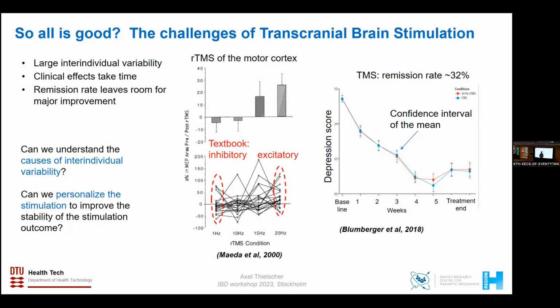You have also a lot of non-responders. So we are really faced with the problem that we still have strong individual variability in our treatment. And we would like to improve on that. And one way of doing this is obviously to personalize the stimulation.